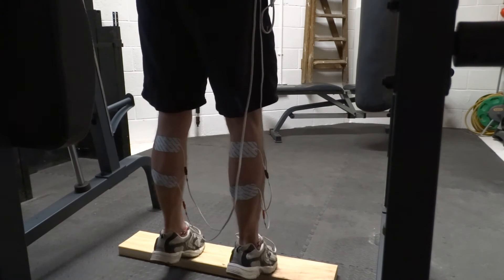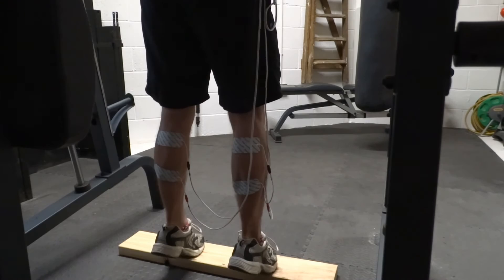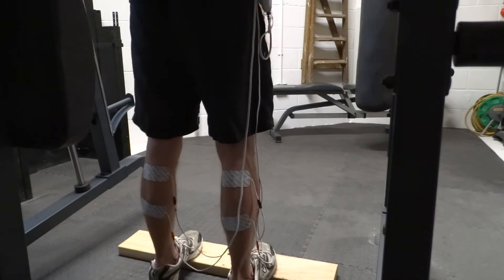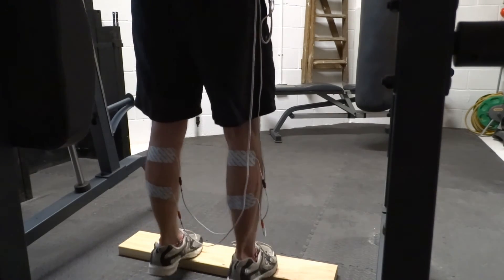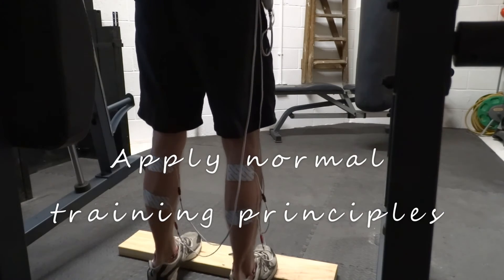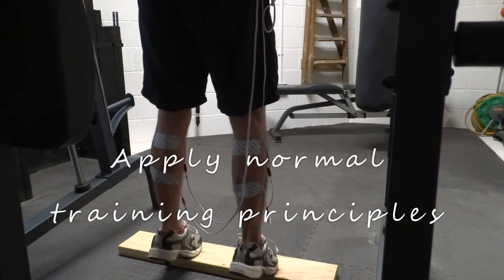Just like normal calf rehab, you can for example do standing calf raises on a step, without a step, or seated calf raises. When using it passively you can run the whole program length. When performing voluntary contractions, depending on your goals, you can apply training principles for strength, power, or endurance.